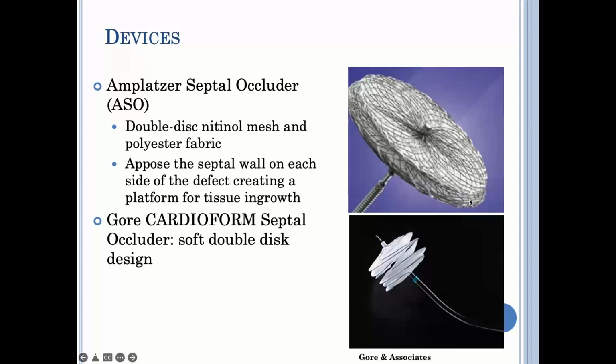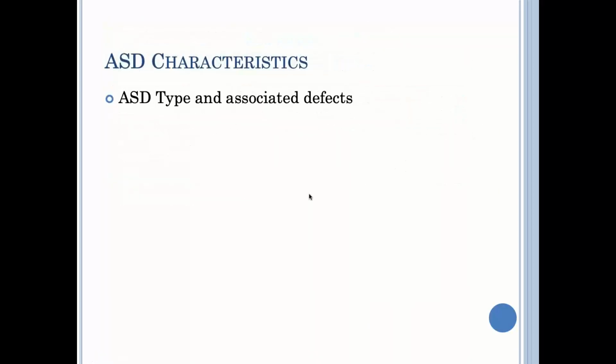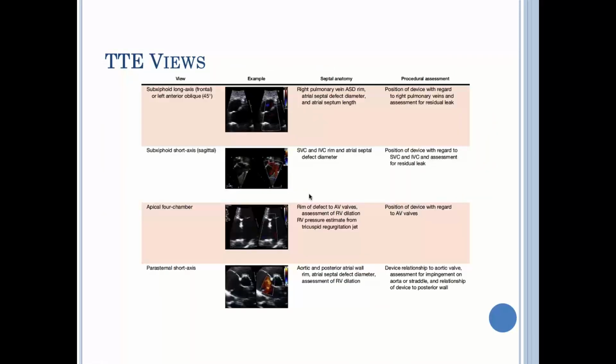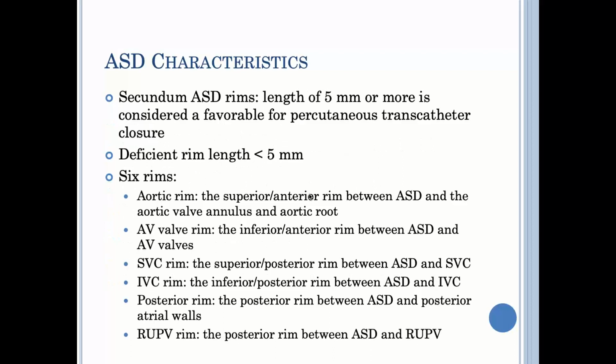Yeah, we can confirm with the interventional colleague. From my understanding, from Dr. Chisholm and other colleagues who do atrial septal defect device closure, 5 millimeters is what we usually go by when we do the TEE. We try to map them all out, like you said. But usually on the aortic side they can tolerate slightly less, because the device once it goes in is like a Pac-Man.